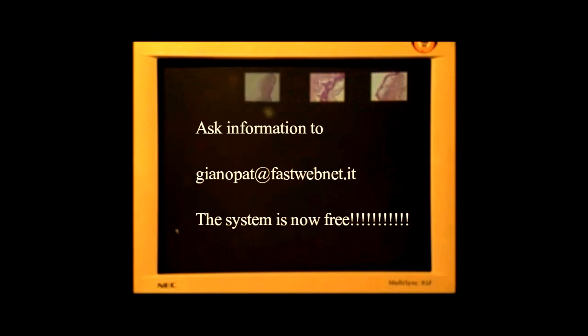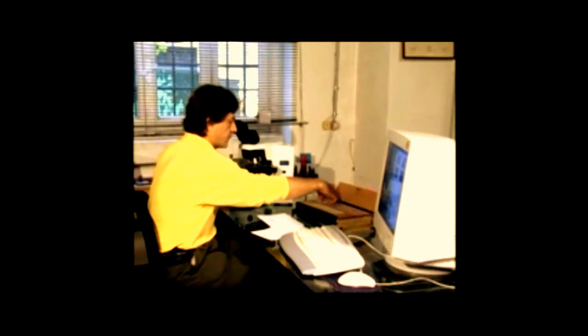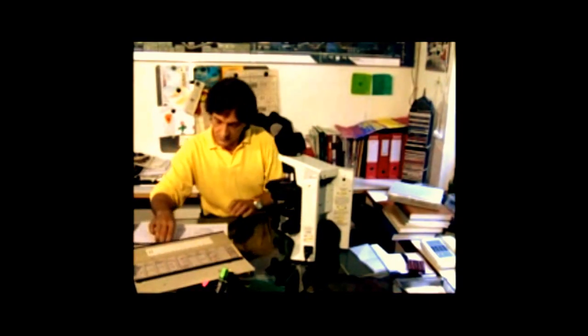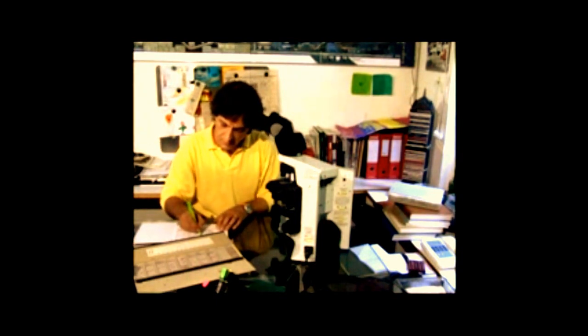Lampyris 101 is a program running on PC in Windows system that has stored histopathological data and pictures of more than 400 inflammatory skin diseases. It is based on the concept of histological reaction patterns, originally conceived by Felix Pincus and then so masterly brought into full bloom by Bernie Ackerman.